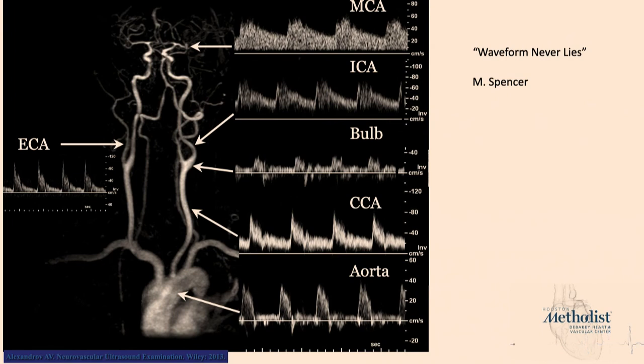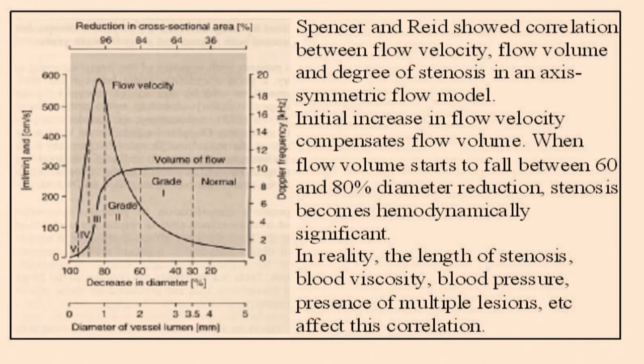I would like to show you a little bit about the waveform. So you saw a little bit of the common waveform, but you can see what the aortic waveform looks like and how we end up with the middle cerebral flow later on. But I think one of the quotes from Dr. Spencer is that the waveform never lies. And I think the Dr. Spencer work really told us what's the hemodynamically significant stenosis. So when I'm looking at the carotid, this is why that 70%, you really want to know it's coming from Dr. Spencer's work. So you see a velocity curve and you see a flow volume curve.